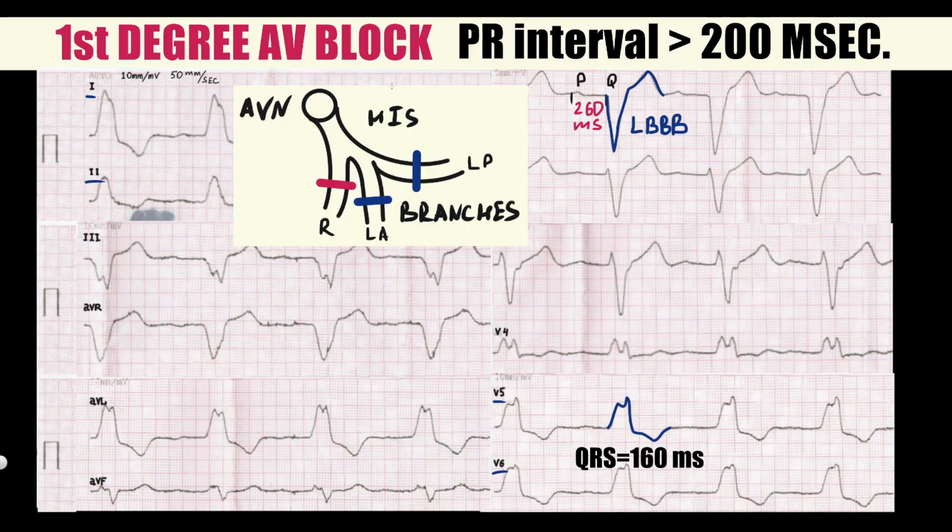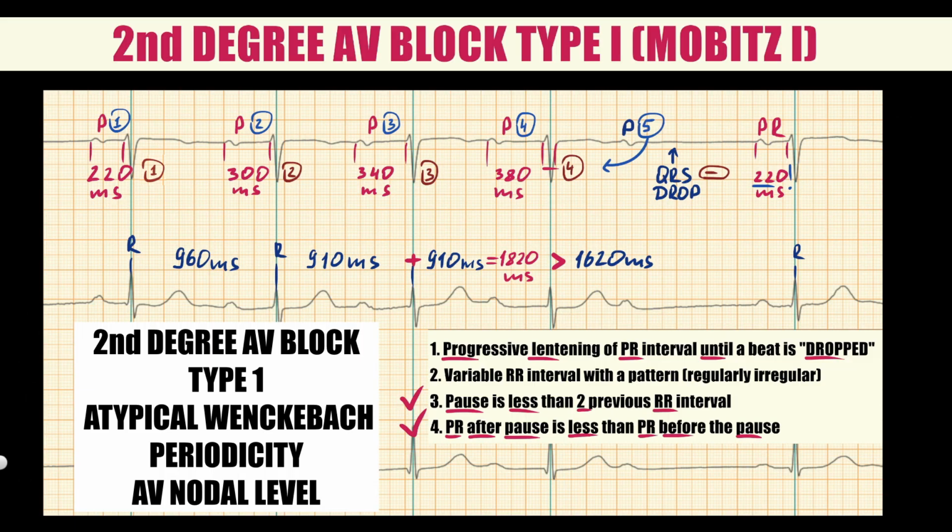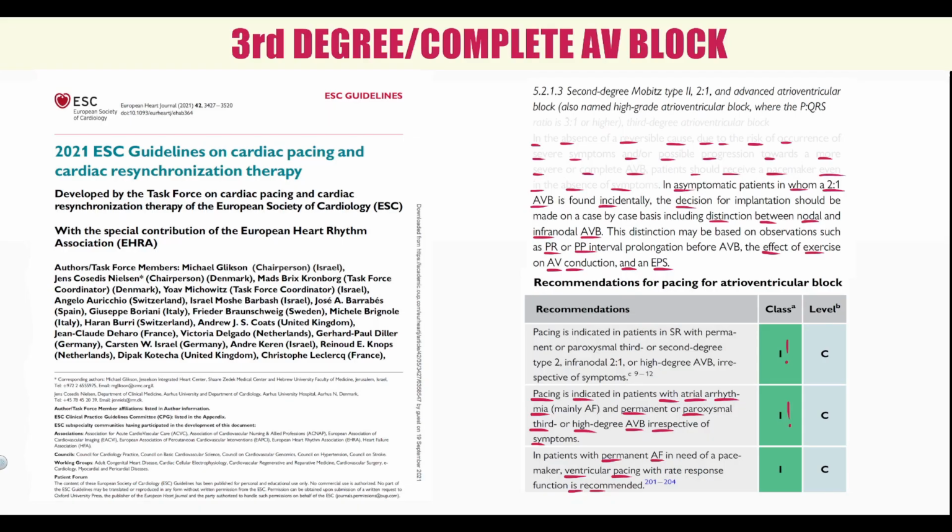Carditis. All degree AV blocks will be followed by real ECG example with explanation and European cardiology guideline recommendations. You can use the time codes for checking the most relevant information for you.